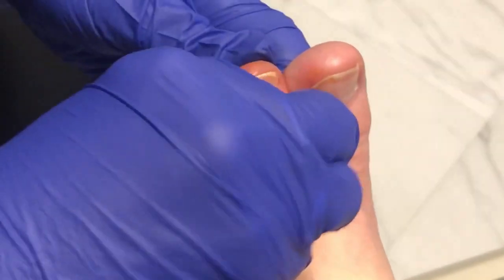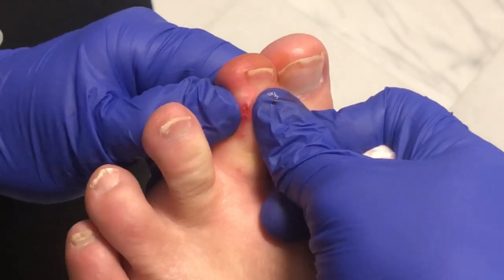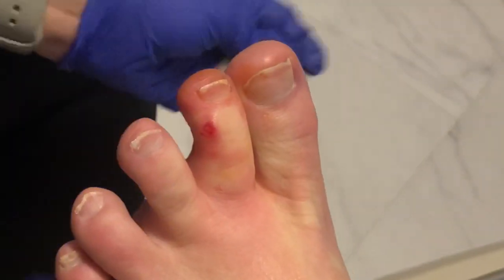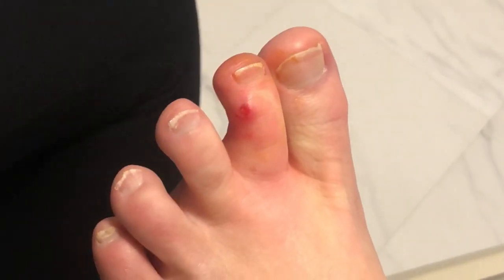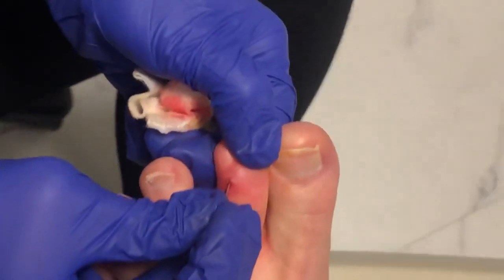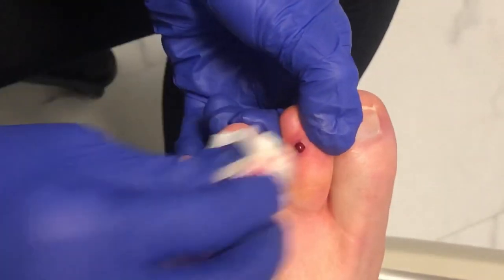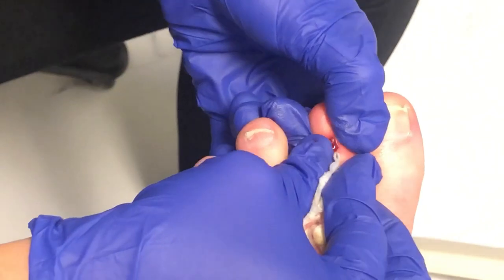This would have really hurt if you hadn't been numbed. I'm going to touch it in there and just make sure I cleaned out as much of it as I could, because I don't want her to hurt when she goes home. The goal is to make her feel better.